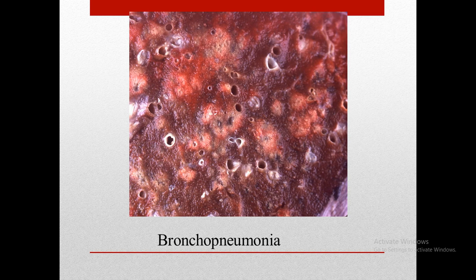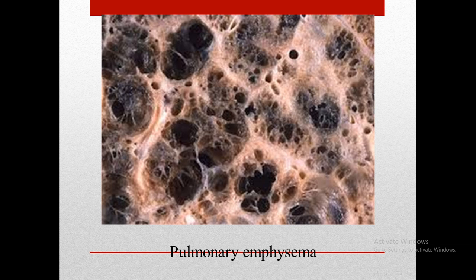As we said in the lecture, it is patchy disease affecting the lung. It's suppurative disease. So we see here the suppuration and pus. Another cut section in the lung, we see the alveoli, which normally couldn't be seen. These alveoli are dilated and open into each other, causing air pooling, and we call this emphysema, pulmonary emphysema.